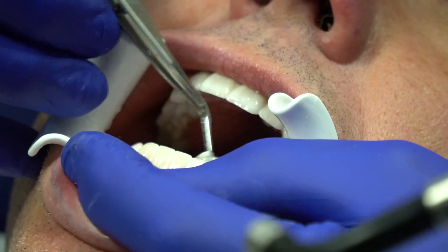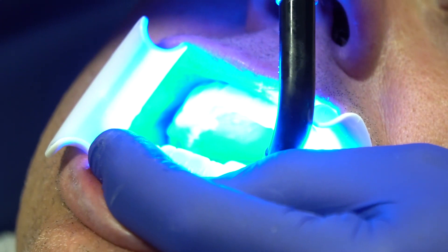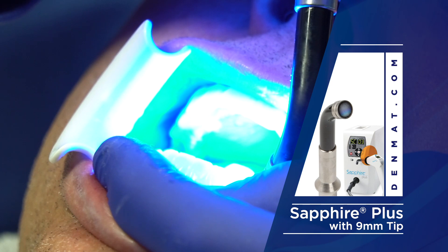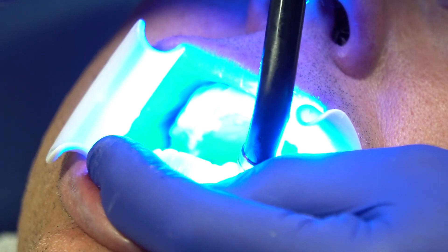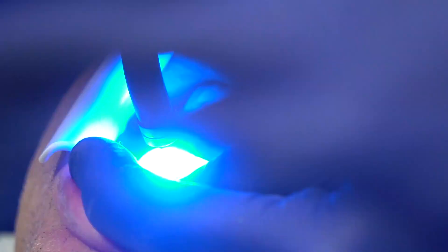Now we're going to come in and cure everything — five seconds from it. If you have a strong arc light like the sapphire, research shows you can hold it away from the tooth and get the whole tooth all in one go. If you don't have that, then do multiple cures per tooth. I have these in every operatory in my office for all my posterior composites.